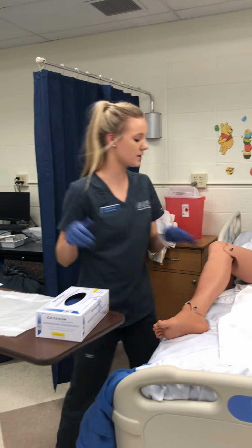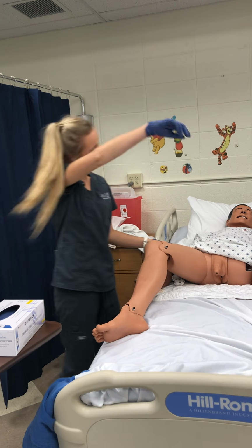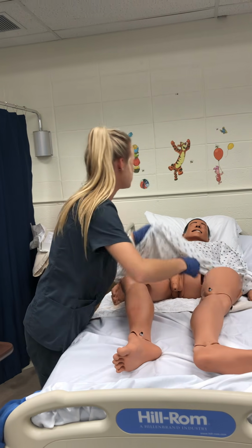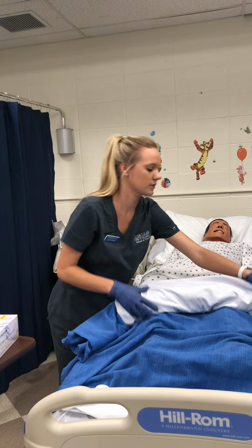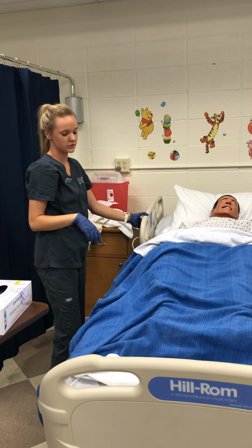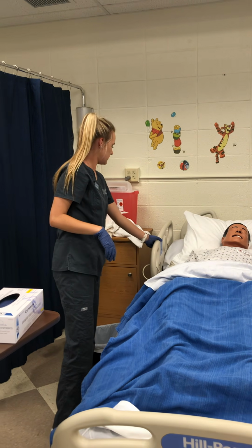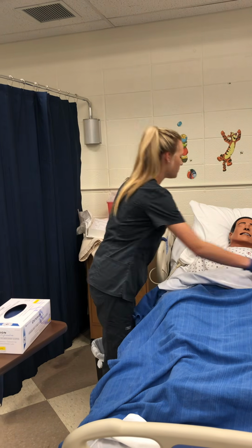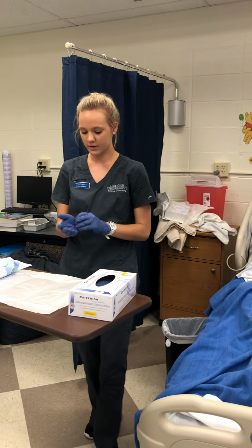I clean up all of my mess, put this in dirty linens. I would let Mr. Jones know you might have some burning or pain the first time you go to the bathroom, Mr. Jones. And if you need anything, you can call me on your call light and get him comfortable again. I'm going to put him back down in the low position and set him up to where he's comfortable. Is that comfortable, Mr. Jones? Good. Okay, so then I would clean everything else up.